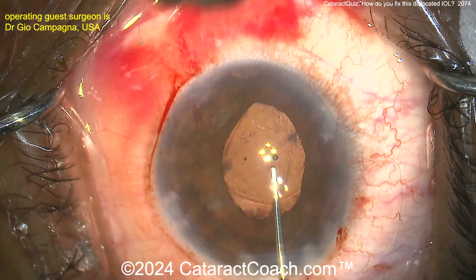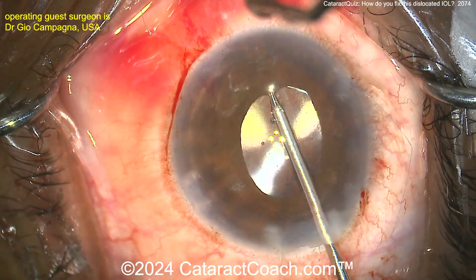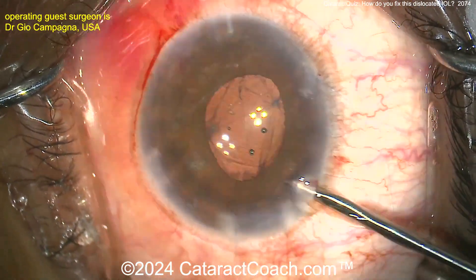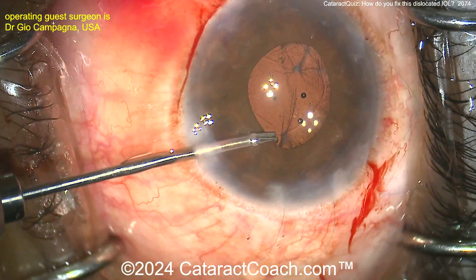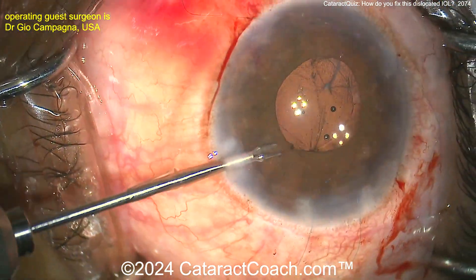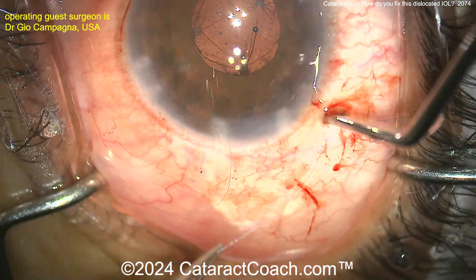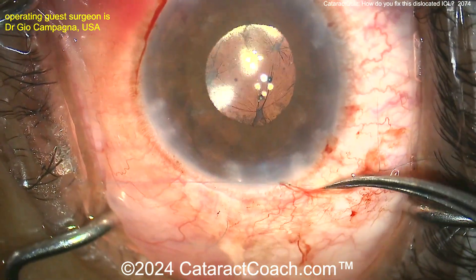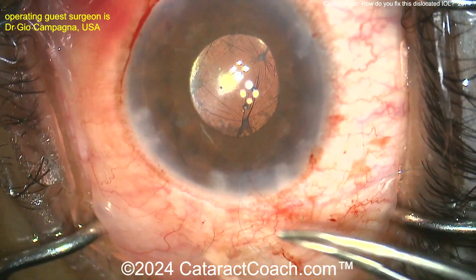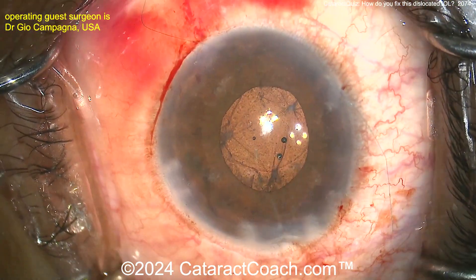There you go — pushing the optic behind. Here's another trick: you can grab with those forceps and pull the iris centrally. Nice trick — I learned that from Ike Ahmed. You can go inside there and grab that and pull the iris more centrally, and by doing that, it's going to give the pupil a little bit more round shape so you're not going to be left with an ovoid pupil. Tie this up and then you're going to finish up the case — beautiful result.